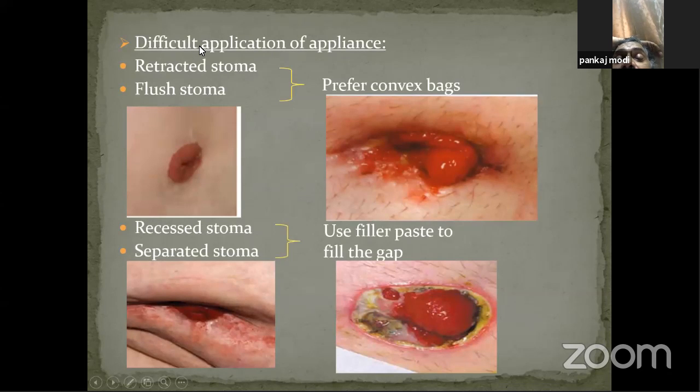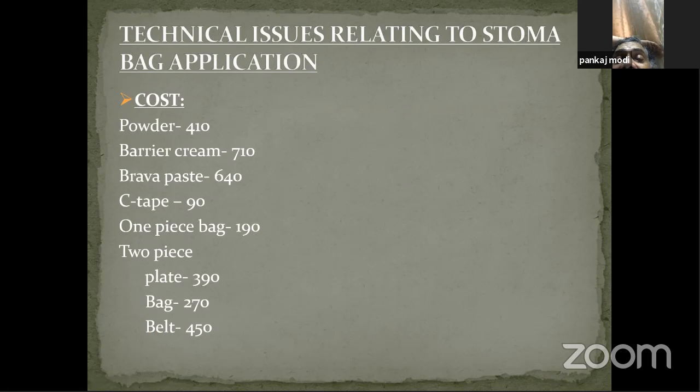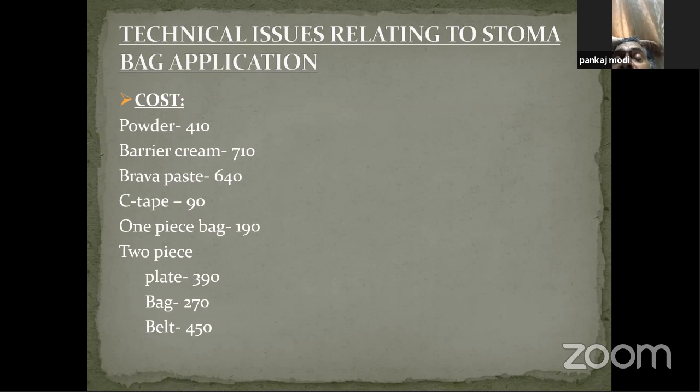No bag, and they can afford the paste? Sir, no, sir, please. How much does one paste last? Sir, it lasts only two dressings, sir, usually. Exactly. So remember, the recurring costs are very high. That's why I was describing the innovative method of a belt only without sticking.